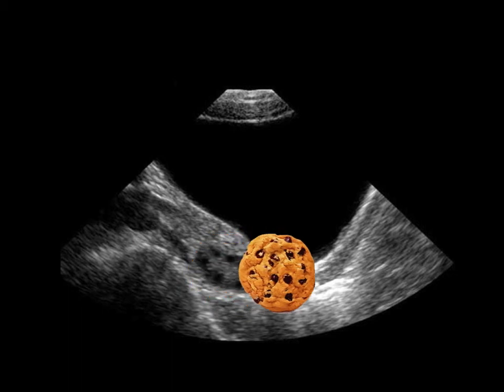So ovaries tend to look like chocolate chip cookies, where you see lots of small hypoechoic or black cysts. These are follicles. Generally, what you want to do in order to look for the right ovary, for example, is slide the probe to the patient's left side and then shoot through the full bladder to get to the right ovary. You want to do the opposite approach to look for the left ovary.